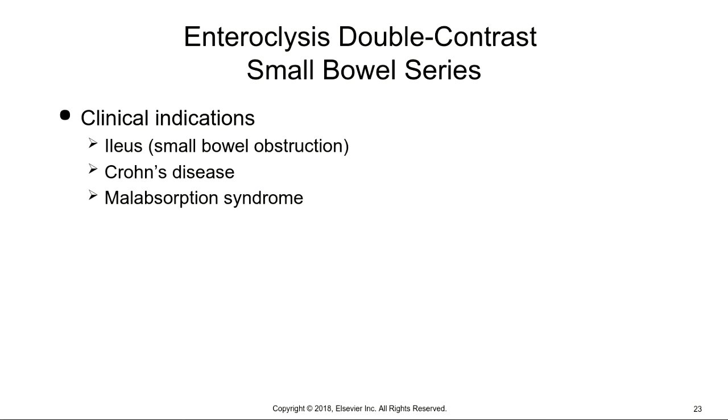Okay, a small bowel follow through is a complete upper GI study followed by a complete small bowel series. So what does that mean? That means that the patient is with you for a long time. They're probably with you a minimum of 2 hours.